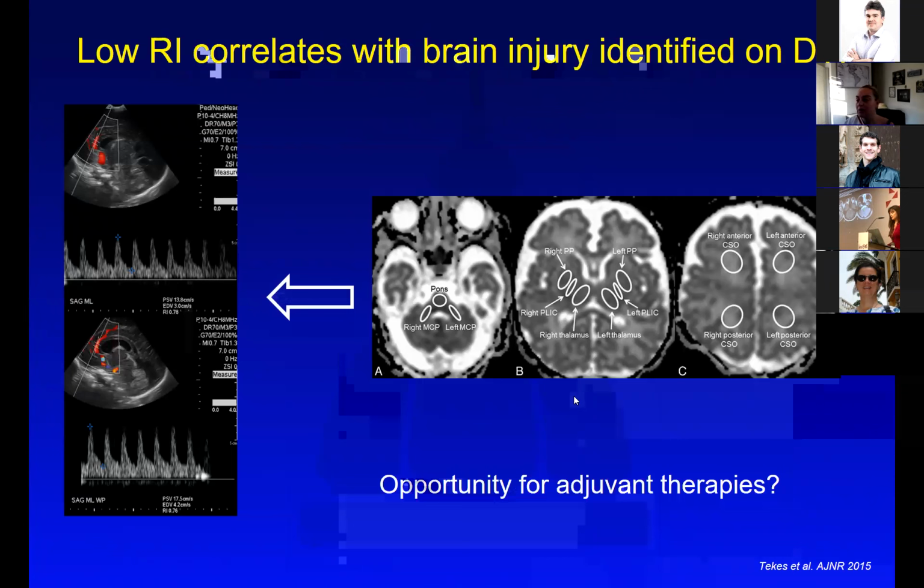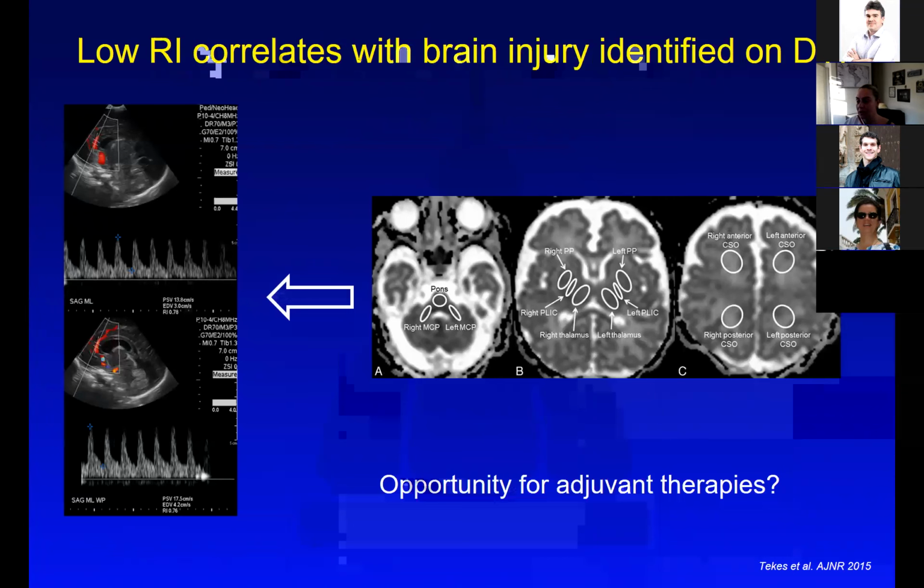Now, we do have access to MRI, and we can do MR in these babies, but still, when you're dealing with a neonate, head ultrasound is a very important tool. It's not that easy to transfer these babies safely. And whatever you can do at the bedside for a NICU infant, that's your top one imaging modality.